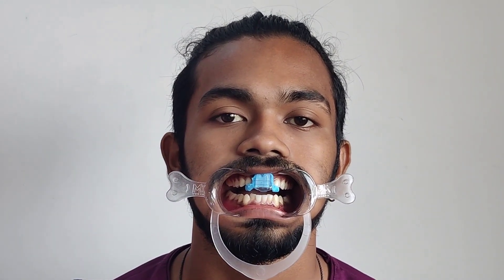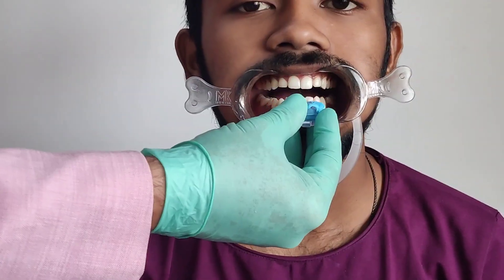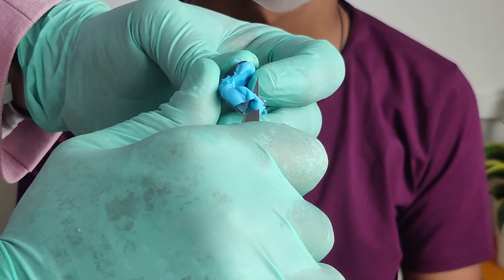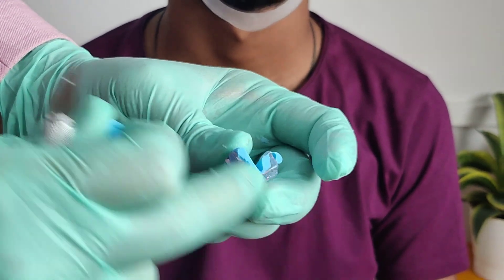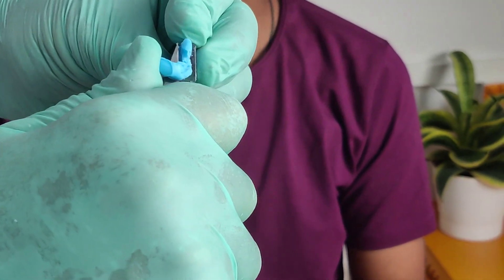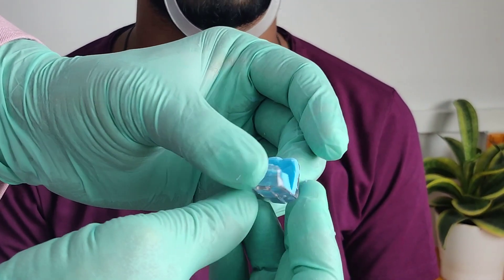Once the entire material has hardened, remove the DT aligner and then retrieve the Unwind MD. There is always excess material present bilaterally, which is why after retrieving we will go ahead and remove that excess. There is adequate retention because the bite registration paste always sets rigid and hard — remember, you do this with bite paste; you cannot do this with putty. I am taking a cutter blade and simply slicing off the excess beyond the confines of the deprogrammer. This is all we need when customizing an Unwind with addition silicone.